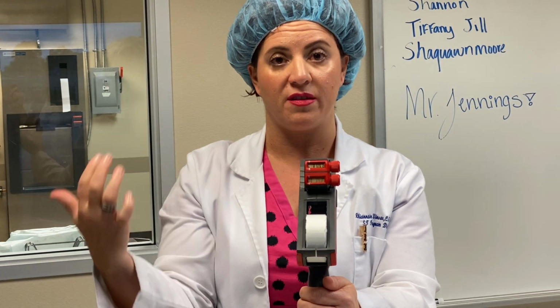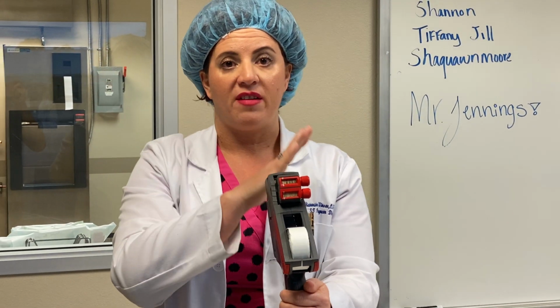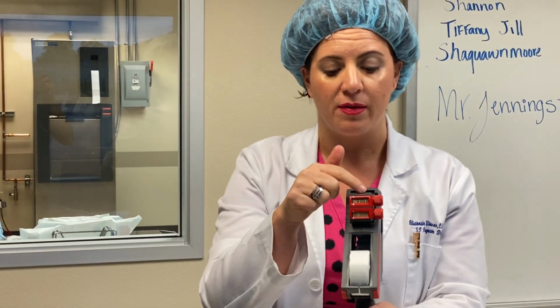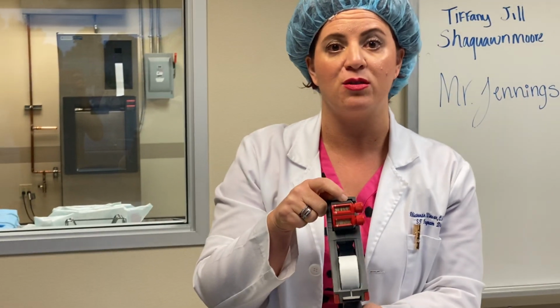Is it the first load? Is it the fifth load? And then the Julian date. Remember, the Julian date is that January 1st through December 31st, 1 through 365. So the number on here right now is set for 70. All right, 70. Somebody figure out what that Julian date is and get back with me.